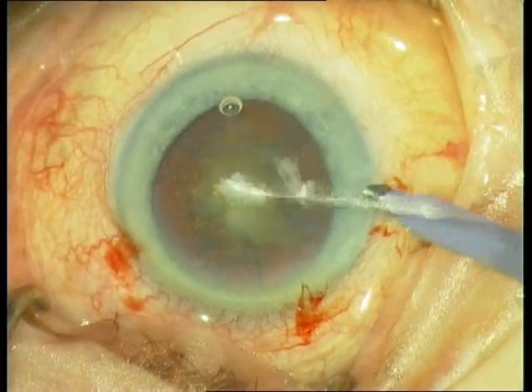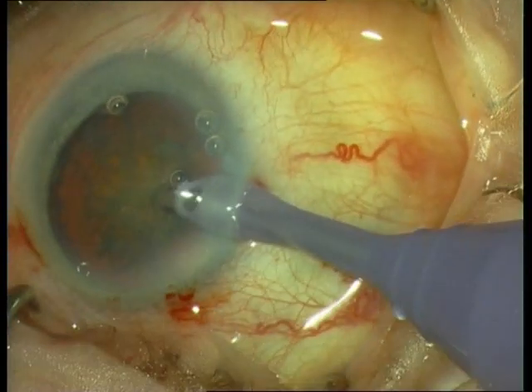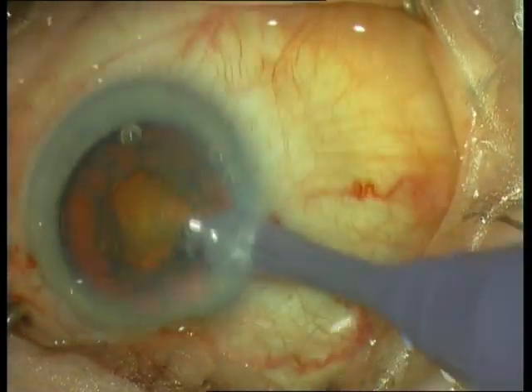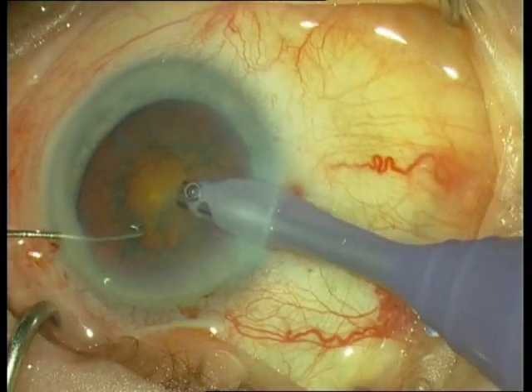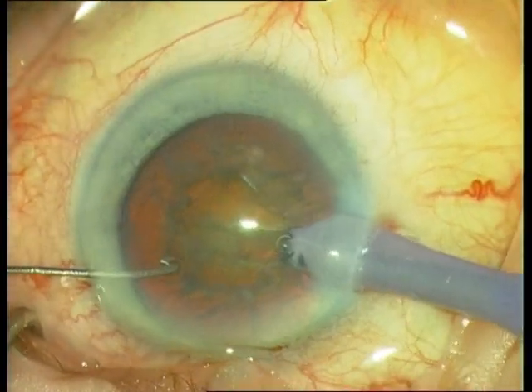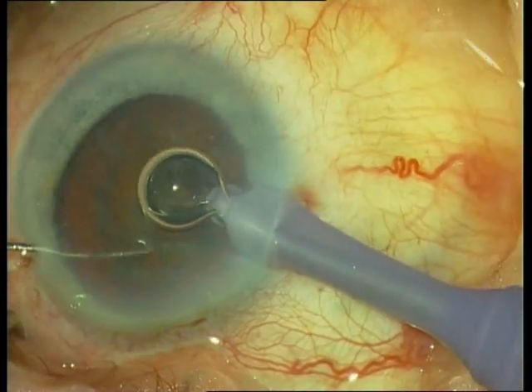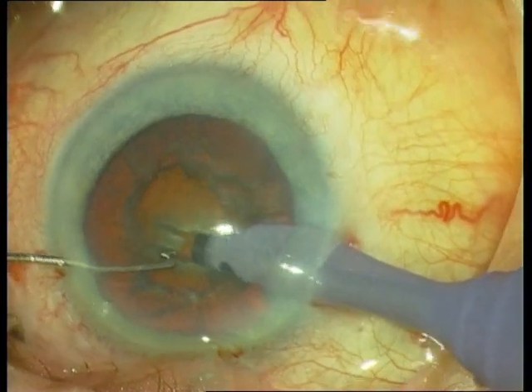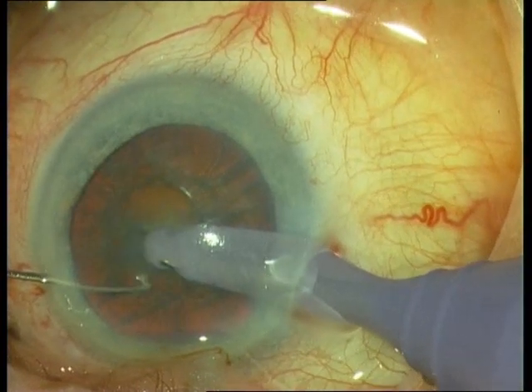The next step is FACO. Insert the FACO tip, infusion on. First remove the epinucleus in order to have a nice good view of the nucleus, and start with the grooving. Always focus on the bottom of the groove and make long movements in order to remove the nucleus.